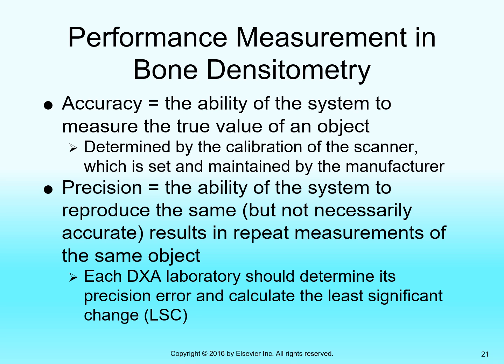The drift in the measurement from one measurement to the exact same measurement: you would totally flip out if you measured an object with a ruler and you got 7 inches, and then the next time you got 8 inches, and the next time you got, I don't know, 6.5 inches. You'd be like, what the hell is going on here, right? If you measure an object with a ruler and you get 7 inches, the next time you expect like 7 and 1/16, or 6 and 15/16, right? And what you expect is precision, okay?